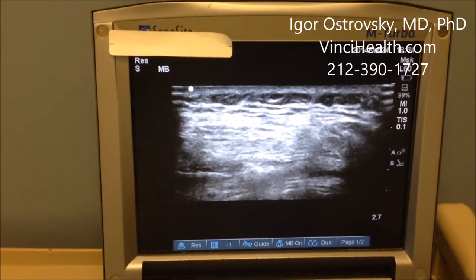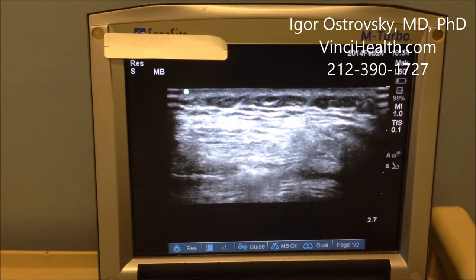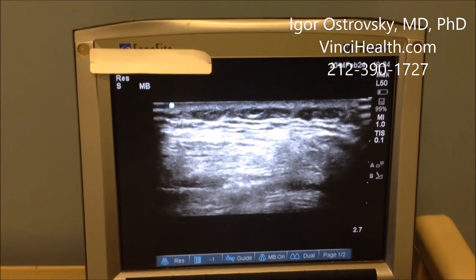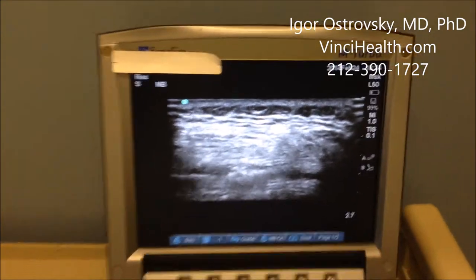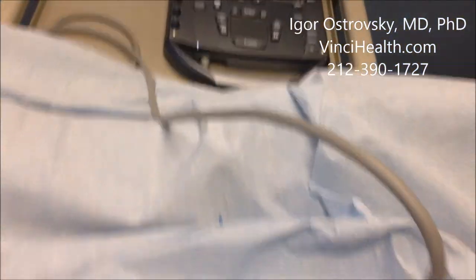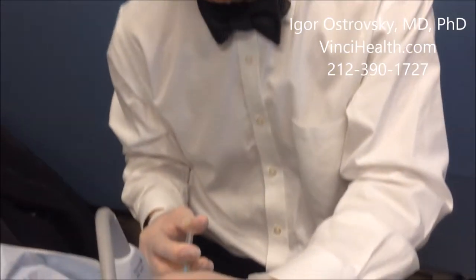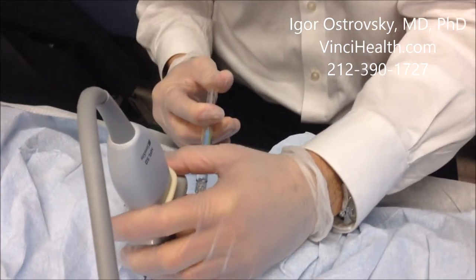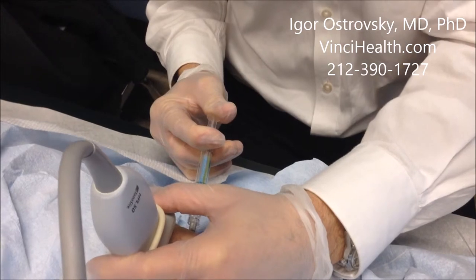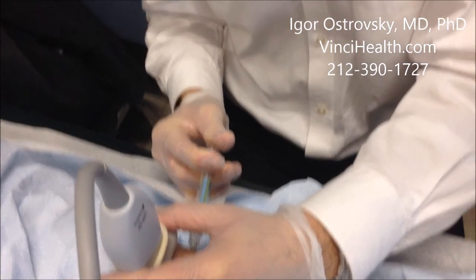This is a safer technique which can be used with ultrasonic guidance. Once I am sure that I am in the right space — the recess — I inject OrthoVisc. OrthoVisc is a brand name for hyaluronic acid.